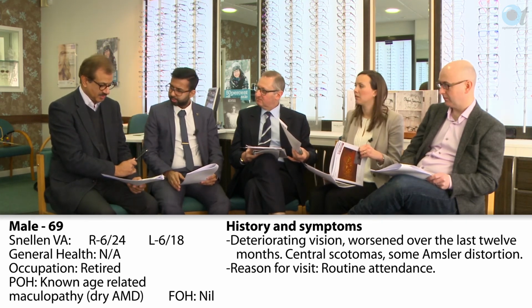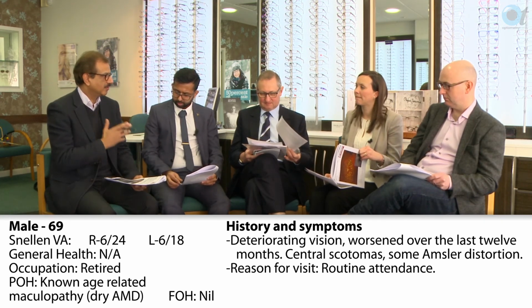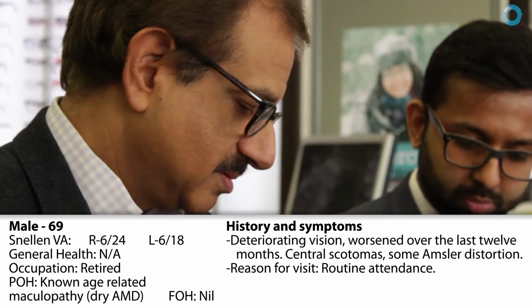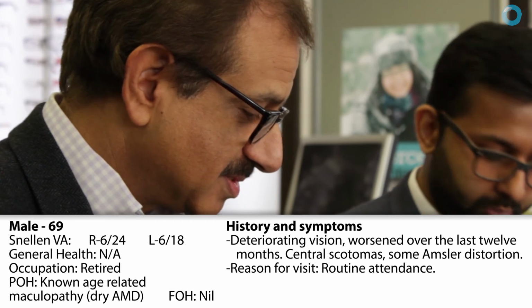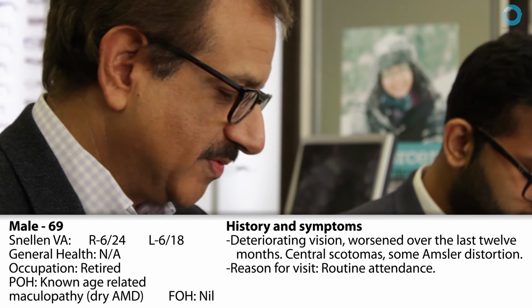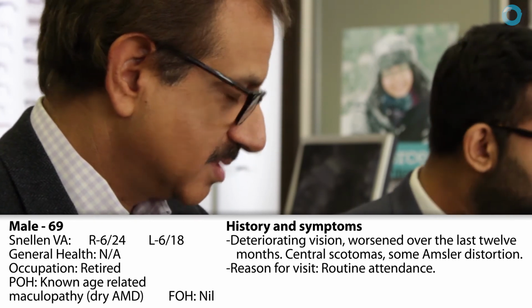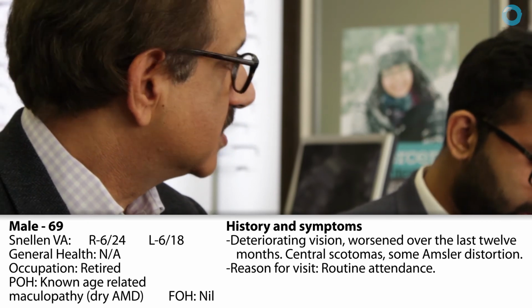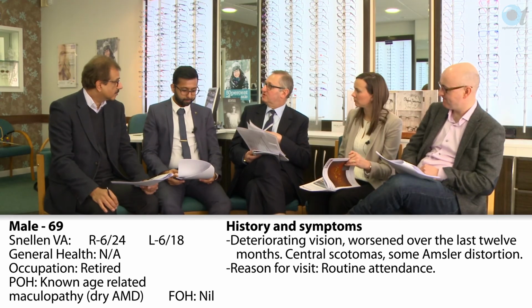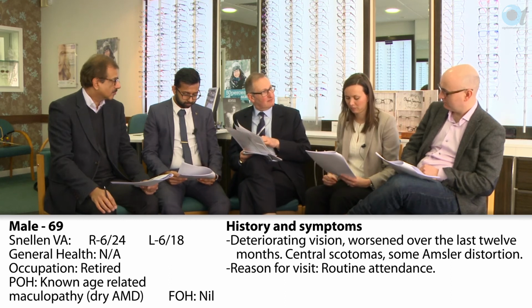I want to play safe with this chap because in the back of my mind I know that dry AMDs can become wet AMDs. It looks a very busy picture as far as the AMD goes, and the fact that it's reduced and we don't have enough information on him, I'd possibly initially like to repeat the OCT to get more information from the OCT rather than rush to the referral pad. Ken, you suggested that we could repeat the OCT, which I think sounds a reasonable idea.